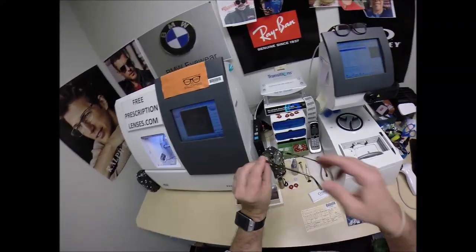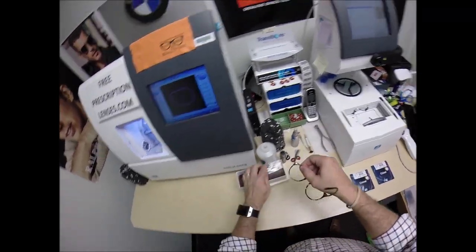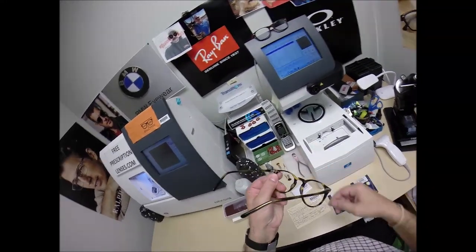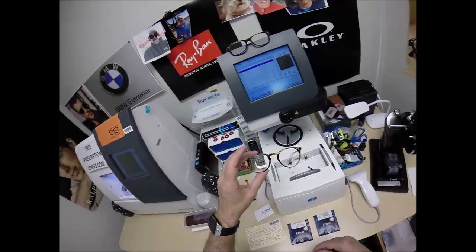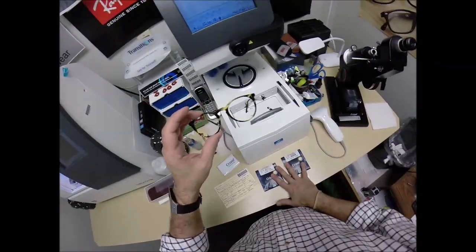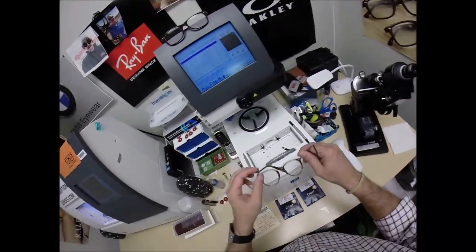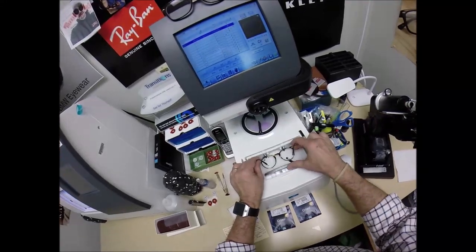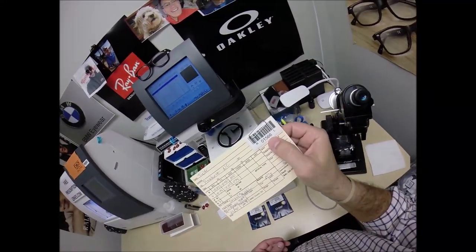I'm going to pop out the original demo lenses of this frame. It is the classic P3 styling. It has — is that a seven-barrel hinge? Very well made, fine Italian craftsmanship. You're going to get some fine French Essilor lenses. Hopefully your frame and lens won't be fighting. I'm tracing it on my Essilor blocker, putting it in to program this shape into the computer.